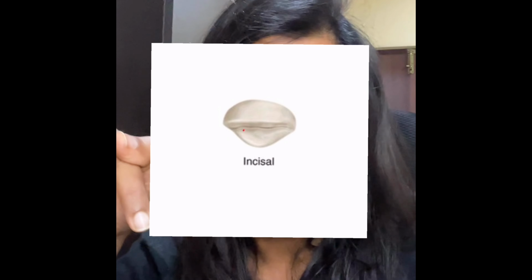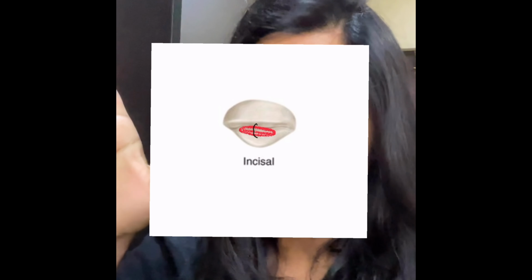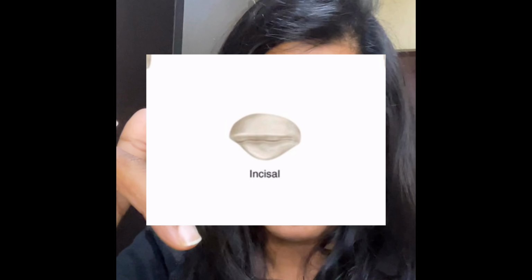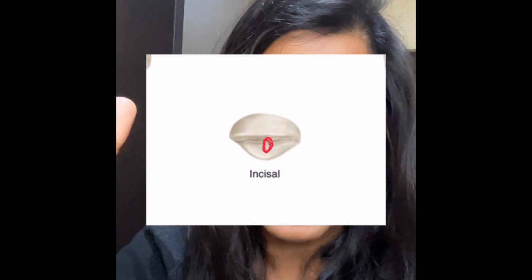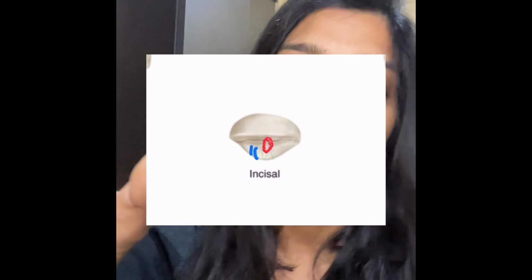If we open an access which is wide mesiodistally, like a straight line, that makes good sense, but your rotary file will not fit because the width is not enough. So to make enough width, we can make a buccolingual access, that is a straight line buccolingually. Then you will be compromising on the cingulum. Cingulum is the part of the incisor which gives greatest strength. So once you damage the cingulum, you're going to weaken the tooth inevitably.